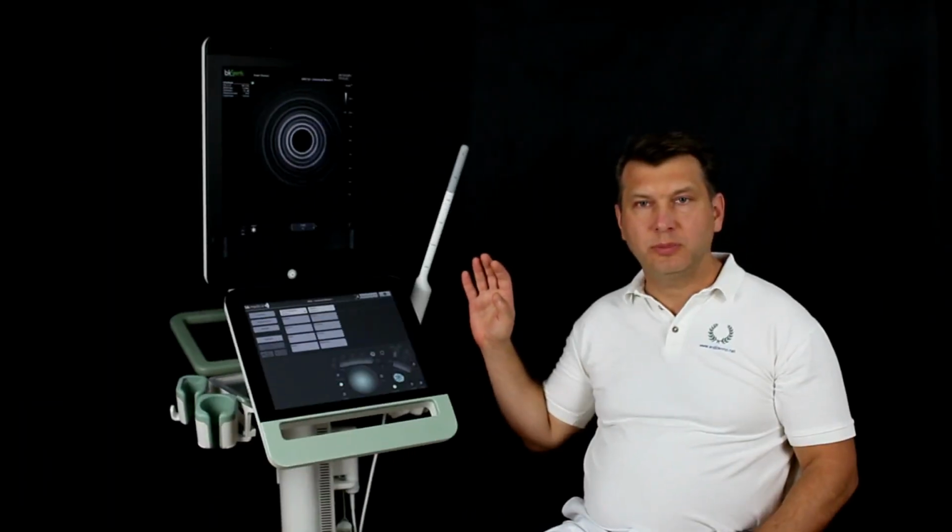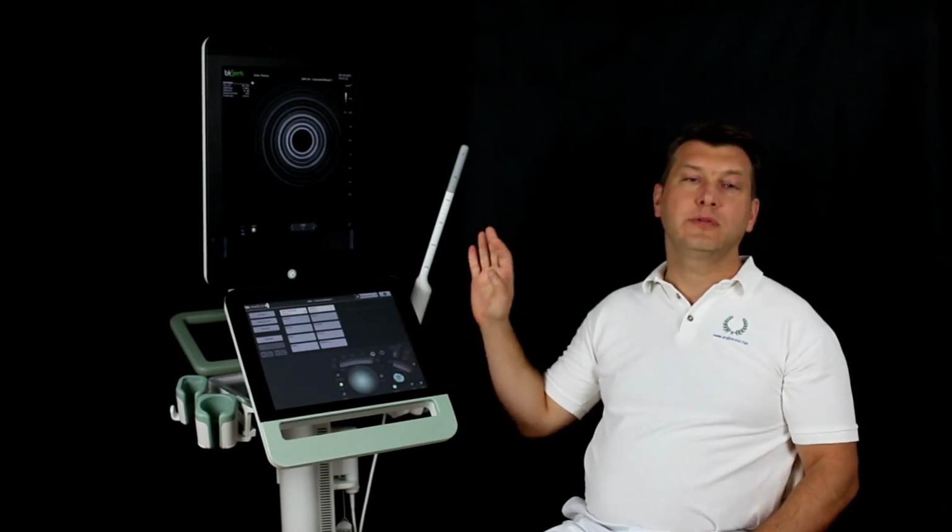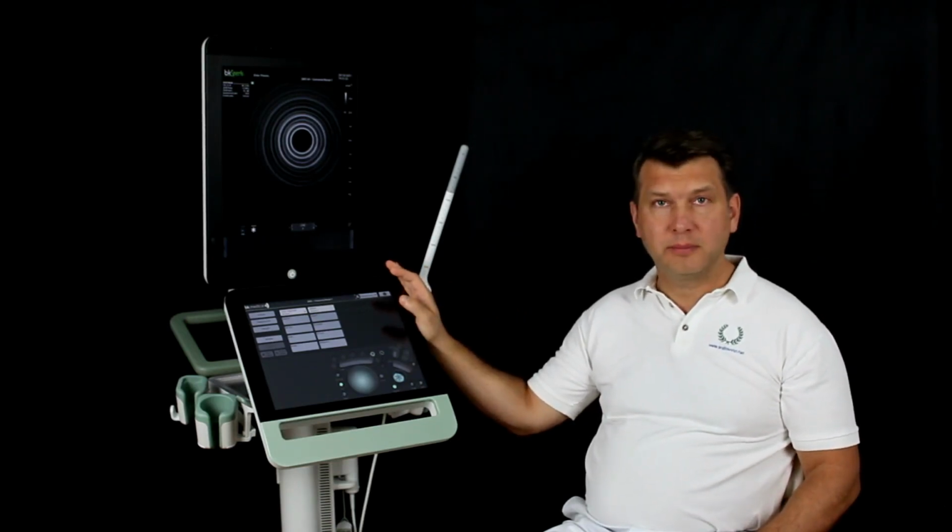In this video I show you how to perform an examination of the anal canal with the Spector from BK Medical.